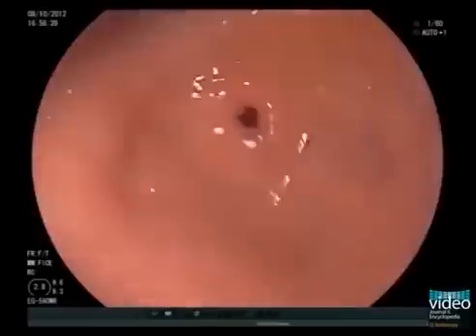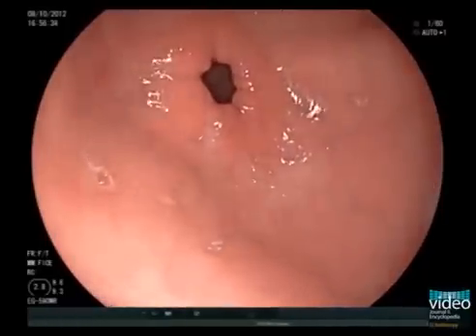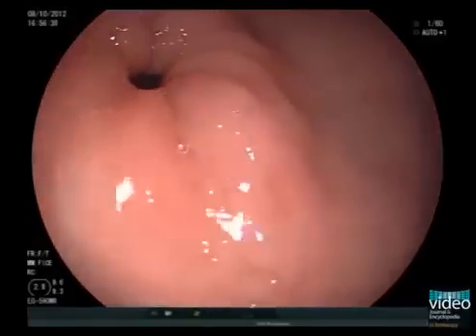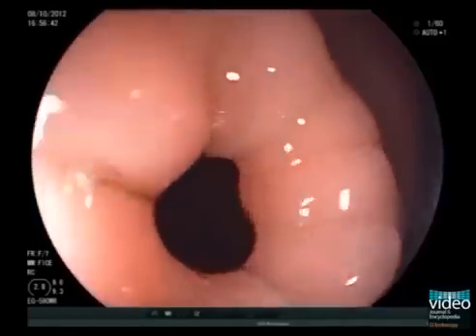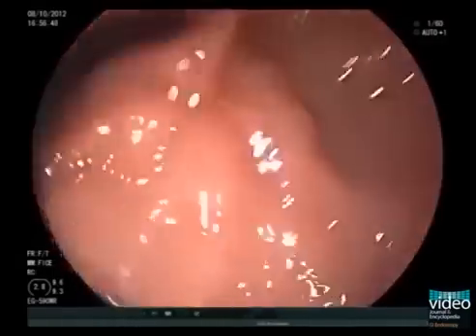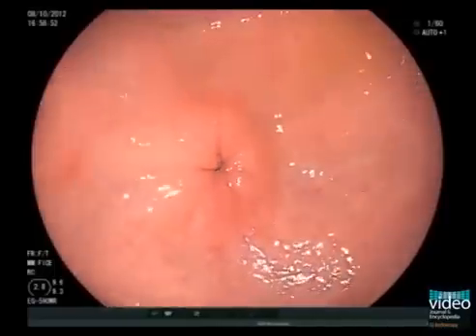To this end, our approach in general is to observe the stomach in detail after, rather than before, the duodenum has been examined. So let us first move to the duodenum. The pylorus is examined closely, with particular attention being given to its motility during peristalsis.